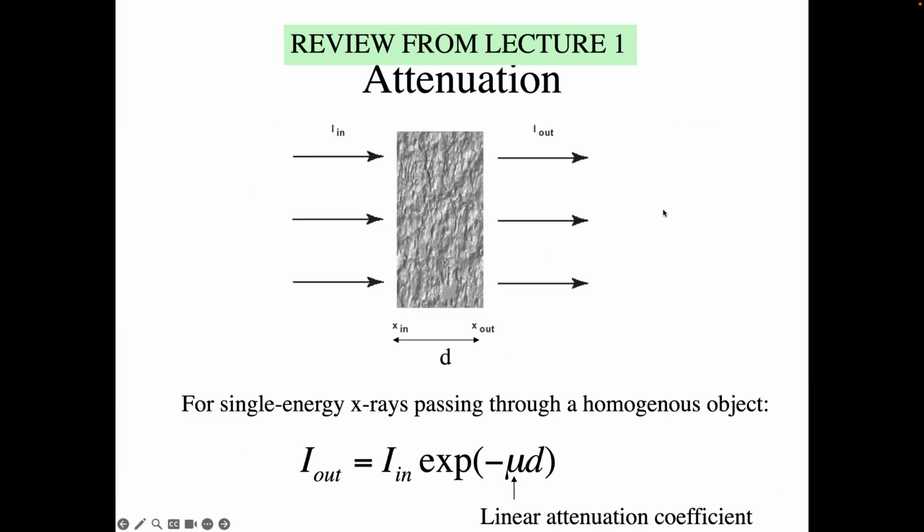So just to review, if I have a substance, let's say this is muscle, right? And I have X-rays going in, and they pass through some distance of the material, and I count how many come out, there's always going to be less, right? I can't generate more X-rays by shining X-ray light into an object. Probably in some physics labs in the world, you can do that, but for this experiment, we don't do that. We just see how many get absorbed.